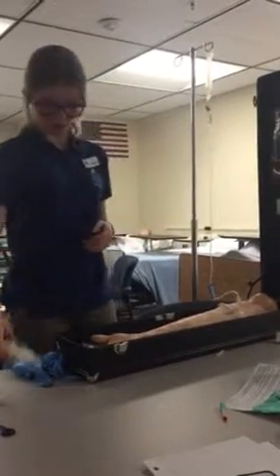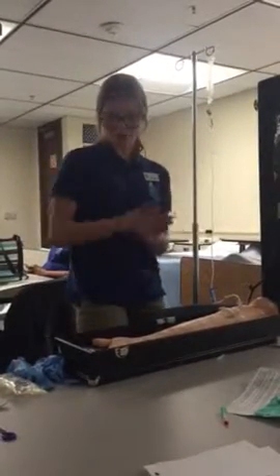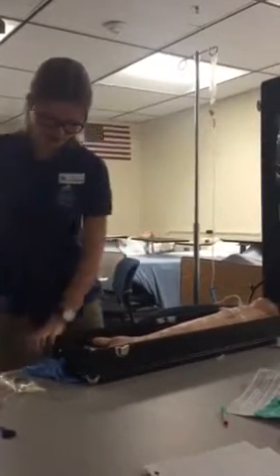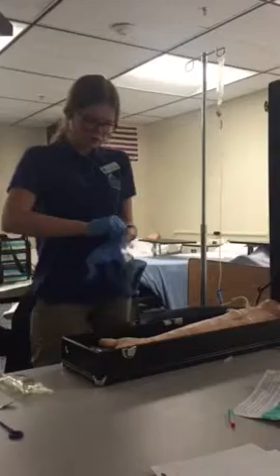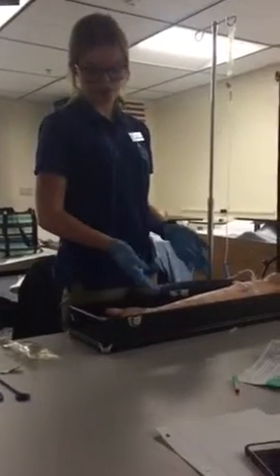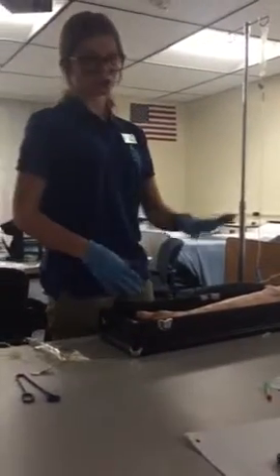Okay. So at this point, you go through your standard precautions. You wash your hands. You'd apply your gloves. You'd ask the patient for 3 identifiers: his name, his date of birth, and where he is. So once you got that done, you also would ask his allergies.